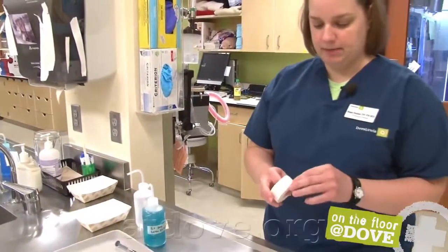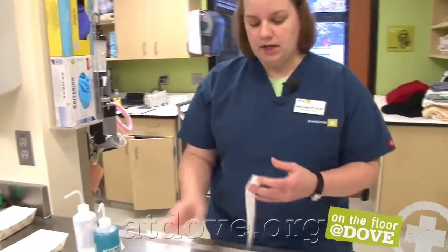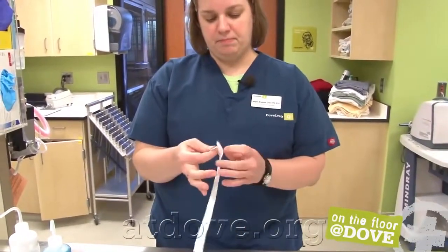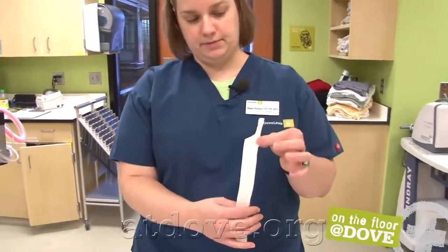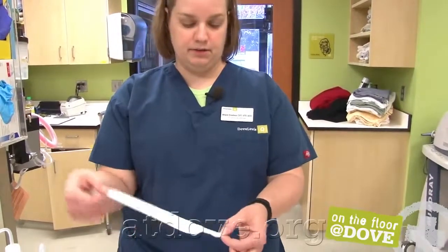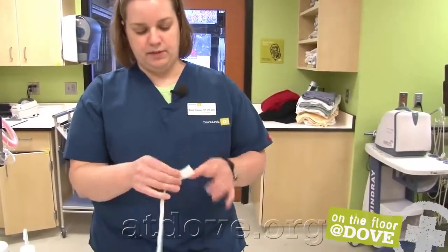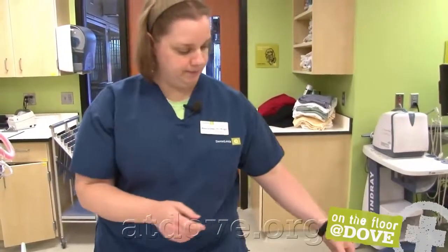First, I'm going to tear some tape. We're pretty particular about the way we tear tape for our IV catheters, just so that we know what to expect if we ever need to remove tape and replace it. So the first piece, I'm going to start by tearing about a half inch to an inch down and wrapping one tab around so it looks like this. This tab is what's going to slide under the catheter in this first piece of tape, and it'll wrap around the leg. Second piece of tape, just make a little notch in it. This is also going to slide underneath the hub and wrap around the leg.